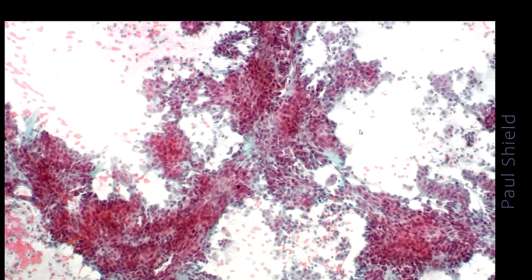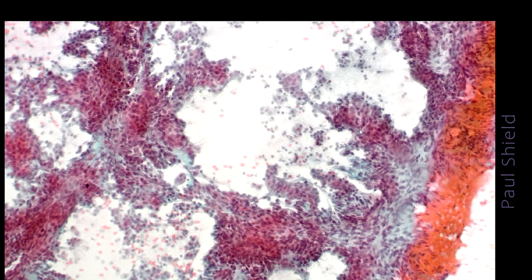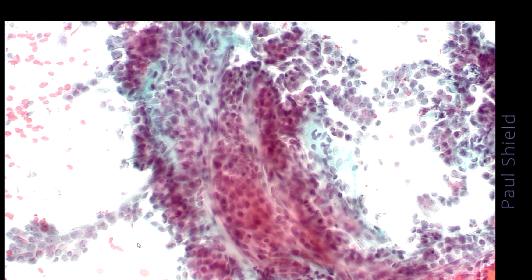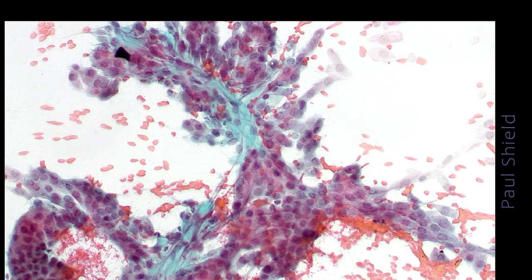Low power again, you can see the cellularity and branching of these large groups. So these have just been sheared off by the needle. Just another high power view. Again, you can see sort of some columnar shapes. And this area shows nicely the branching fibrovascular core, epithelial cells in sort of sheets arranged around it. And sometimes they form quite complex folded sheets.